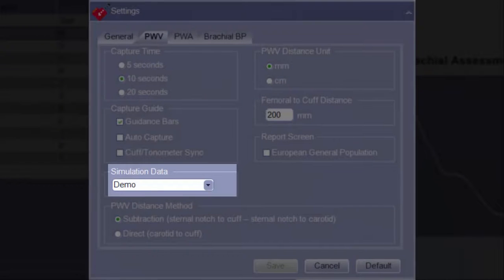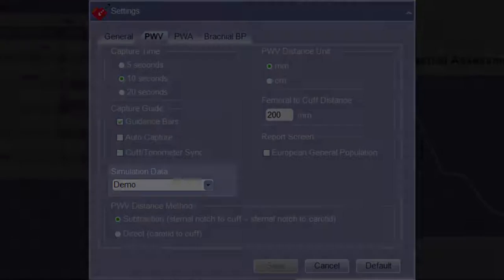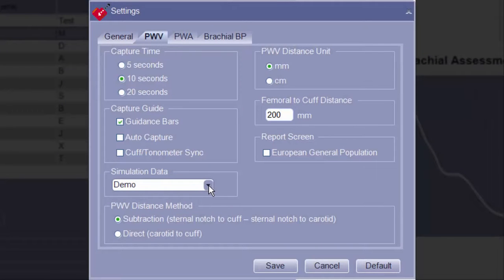In the Simulated Data section, the default file used during simulated assessments can be selected. Additionally, when an error is encountered during pulse wave velocity assessments that prevents a report from being generated, a simulated file is automatically created and placed in the simulation directory. This file can then be selected from the drop-down menu and used as a source of troubleshooting.